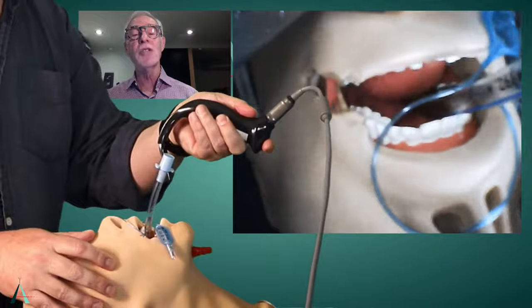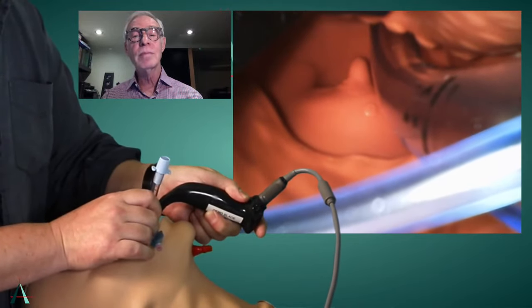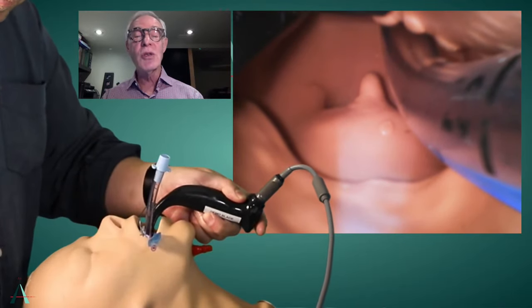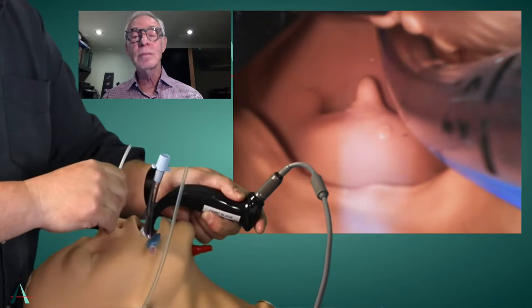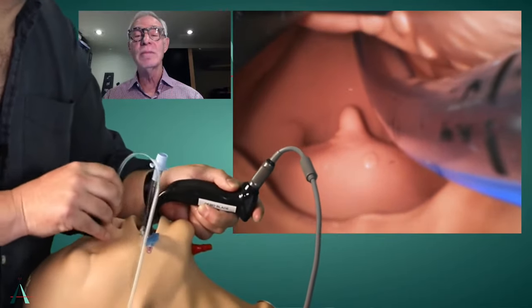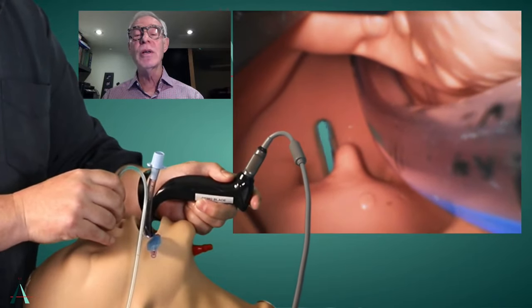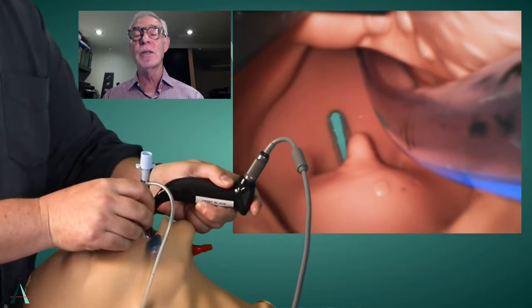So my suggestion is that you take your laryngoscope and you visualize the uvula. Okay. Now take your nasogastric tube or have someone else insert a lubricated nasogastric tube. And I'm putting this in through the nose. Yep. And we'll wait until it happens. Okay. Stop. Now reposition your laryngoscope so that it's posterior to the endotracheal tube.